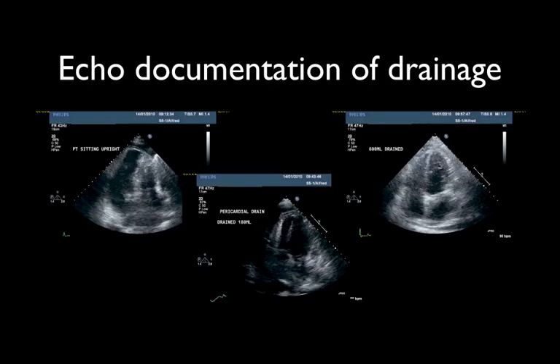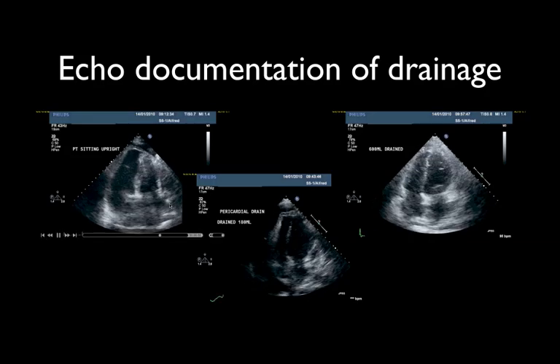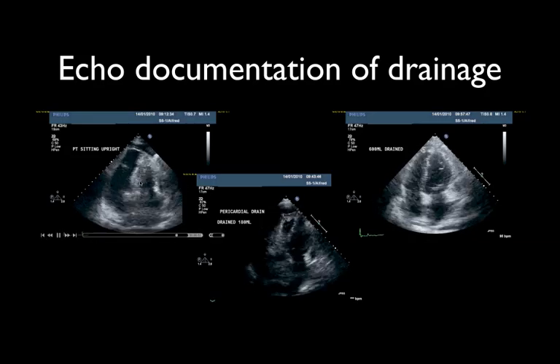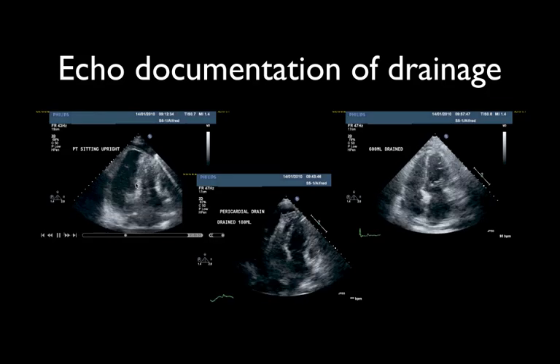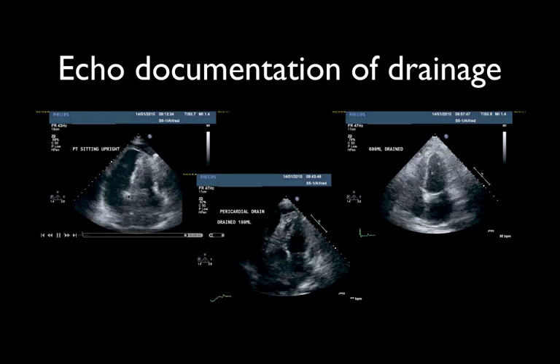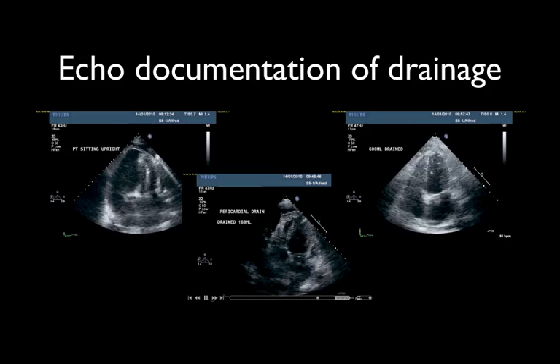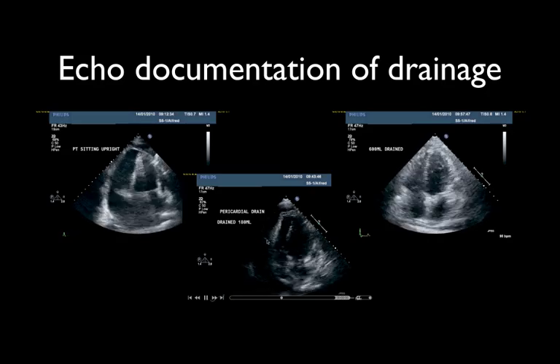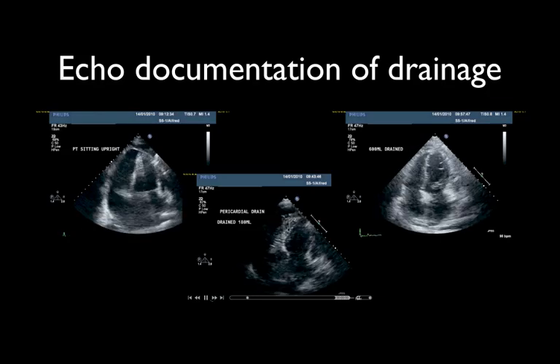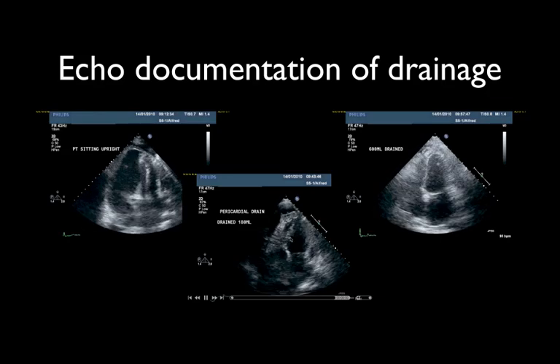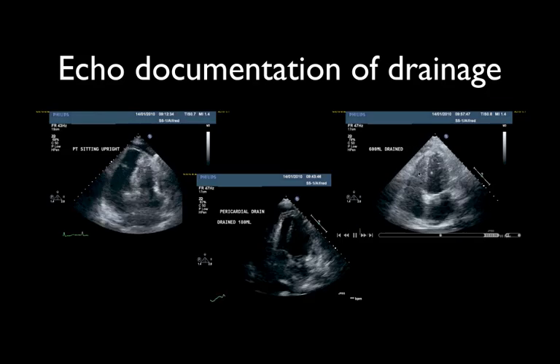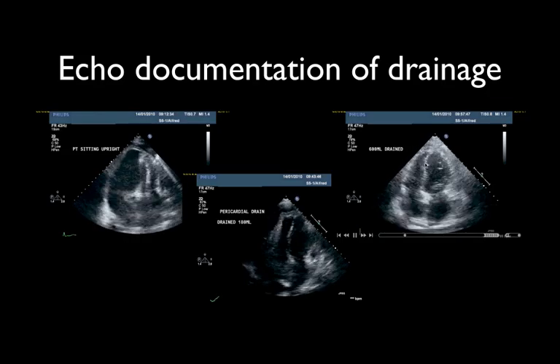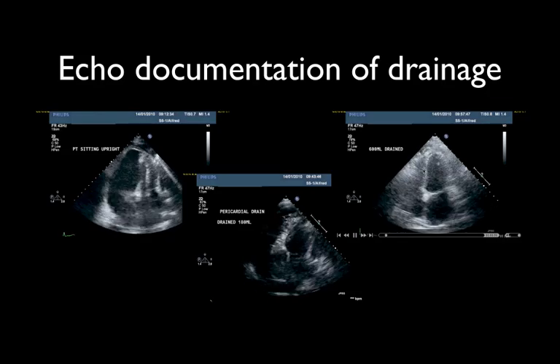Here is the progressive documentation of improvement. Initially the right ventricle is almost squashed tightly shut with the patient sitting upright. Once 180 mils of effusion have been drained, the right ventricle is starting to appear as a small slit-like structure, and finally when 600 mils of fluid have been removed, the right ventricle is looking much more normal.